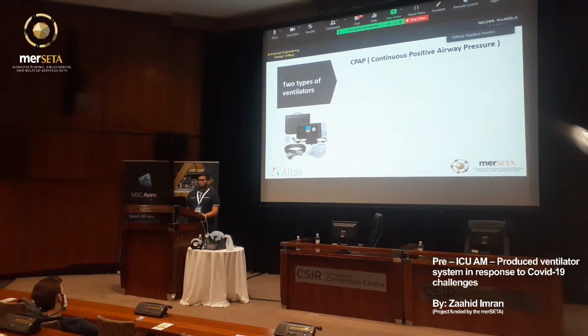So there are two main types of non-invasive ventilators. We've got our CPAP machine first of all, which stands for continuous positive airway pressure. The CPAP machine produces pressurized air at a continuous steady amount. The basic disadvantage of a CPAP machine is that it doesn't sync with the breathing system of a patient. So the patient is breathing out and the ventilator is pushing air into the body. This makes the patient very uncomfortable.